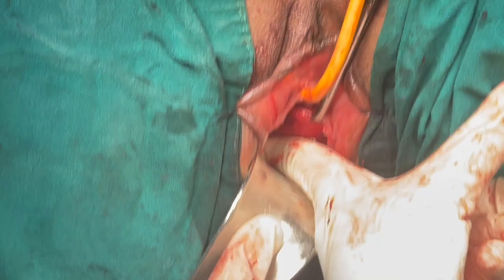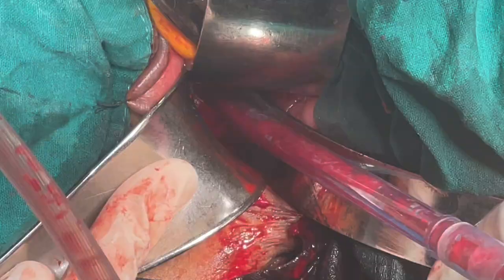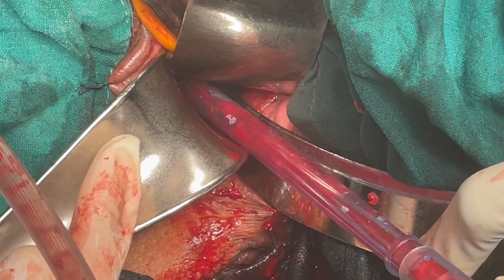Try to palpate the sacrospinous ligament here. Once you are sure of your dissection, put three long-bladed retractors. The superior retractor here retracts the rectum superiorly.